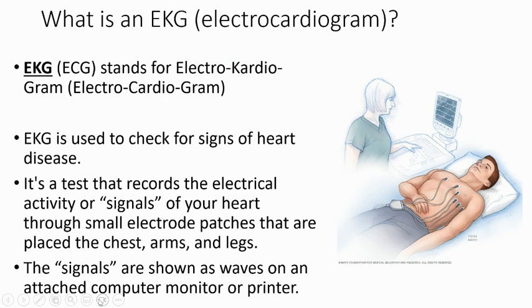It could be EKG or ECG depending on how you're spelling cardio. Basically where you're from is what that's coming from. So it's used to check for signs of heart disease. It records the electrical activity or the signals of your heart.